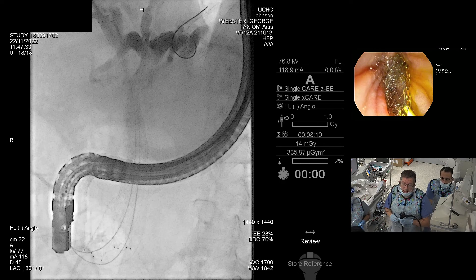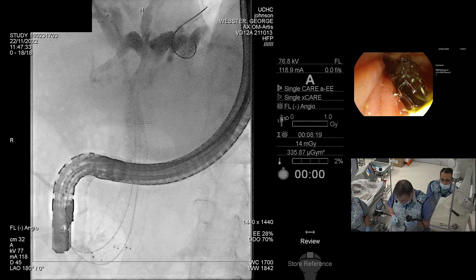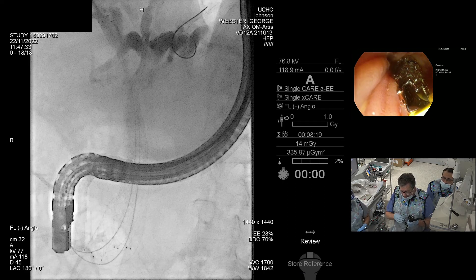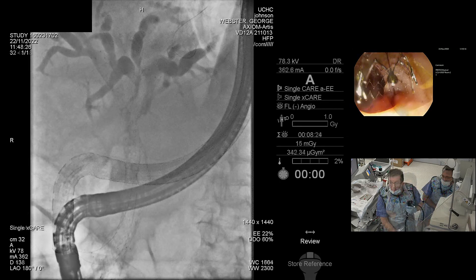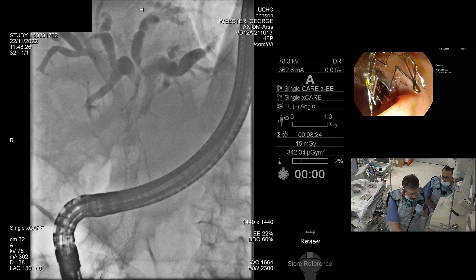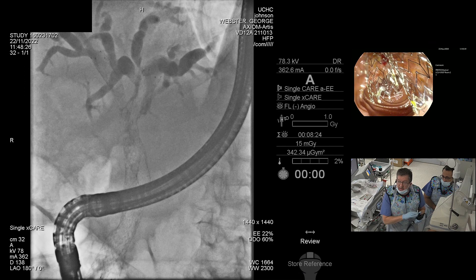That's a great result — really nice bilateral metal stenting. Having the confidence of both stents deployed with both delivery systems side by side in position is excellent. We've all had the occasion where one stent is deployed and then, because of the tightness of the stricture, you have an absolute devil of a time trying to get the other stent in. We always like what we call the 'shotgun' at the end — having both stents coming out into the duodenum so that we can go back in and access them at a later date if needed.